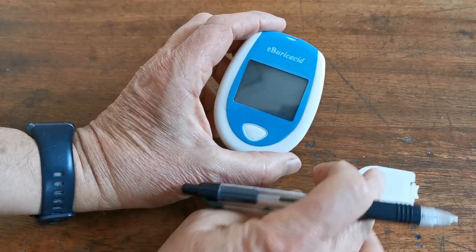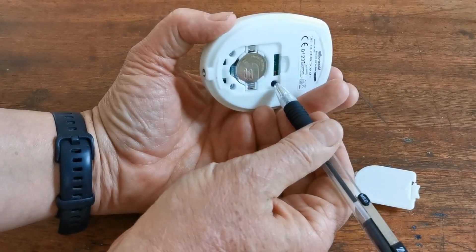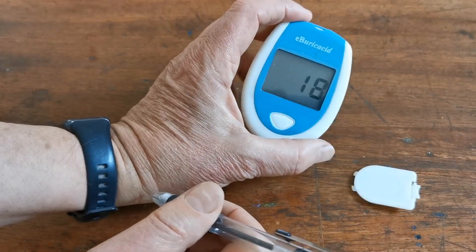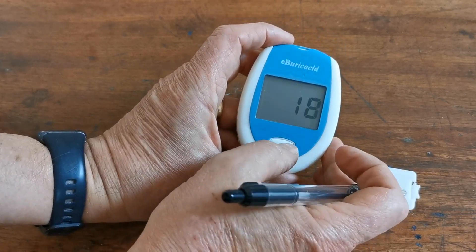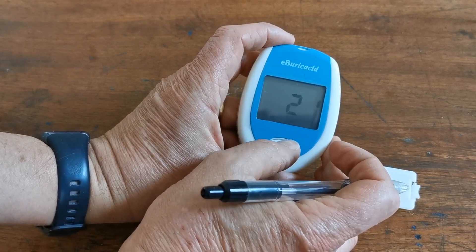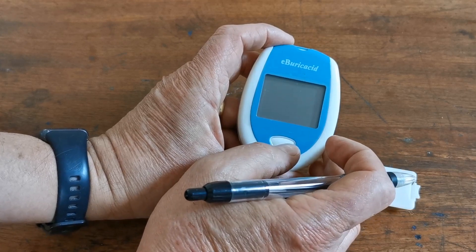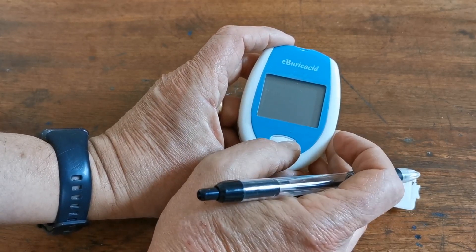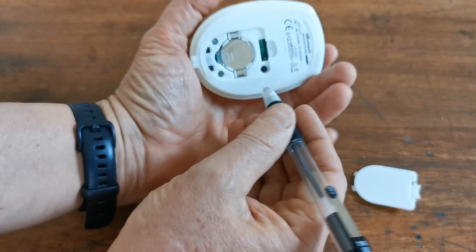Now if you turn it over the screen will be blank. Push the setting button on the rear — if you push it once it initially gives you the option to set the year. You can use the front button to select the correct year. It defaults after about year 2050 back to 2018 and you can then work your way around to 2024.